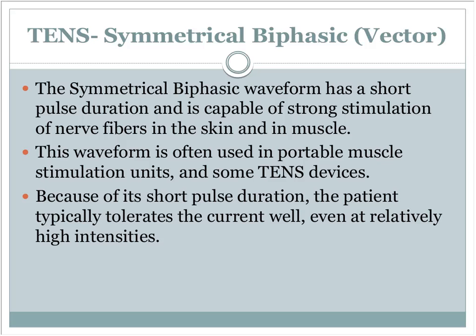One of the things I always say about TENS is we don't put TENS on somebody and then say, okay, I took care of your pain, you can go away. And we'll talk a little bit later, but part of it is understanding what's causing the pain. And sometimes that is weakness, or they have pain in a joint that if they can exercise that joint, that pain will reduce automatically or by itself. So a lot of times I'll put TENS on people and have them exercise while the TENS is on, increasing it or decreasing it depending upon the intensity of their pain, modulating that sometimes myself, not letting the machine do it because the machine will deliver it constantly at a set level.